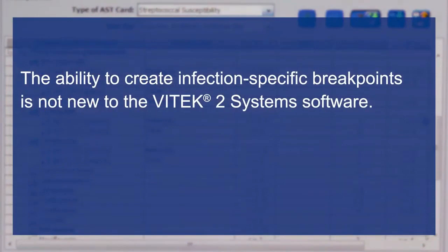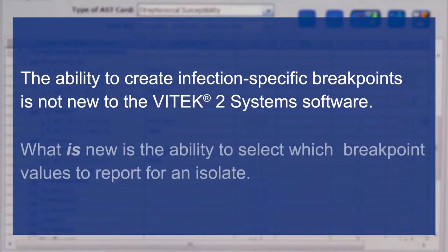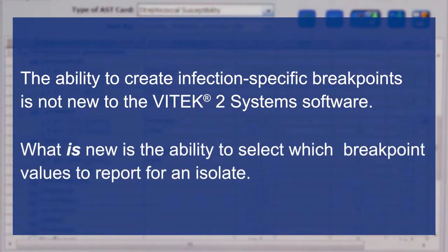The ability to create infection-specific breakpoints is not new to the Vitec2 system software. What is new is the ability to select which breakpoint values to report for an isolate.